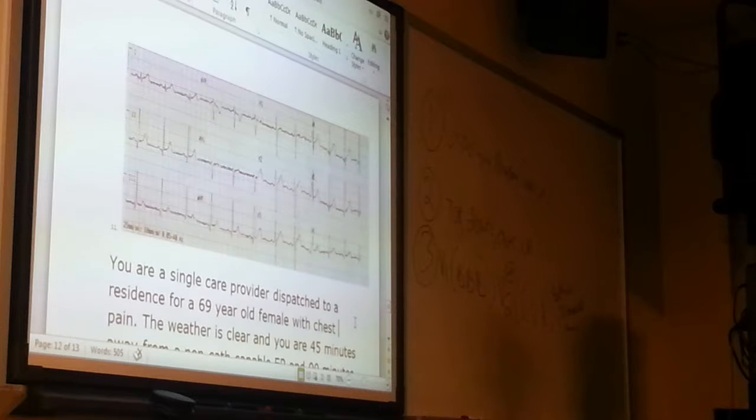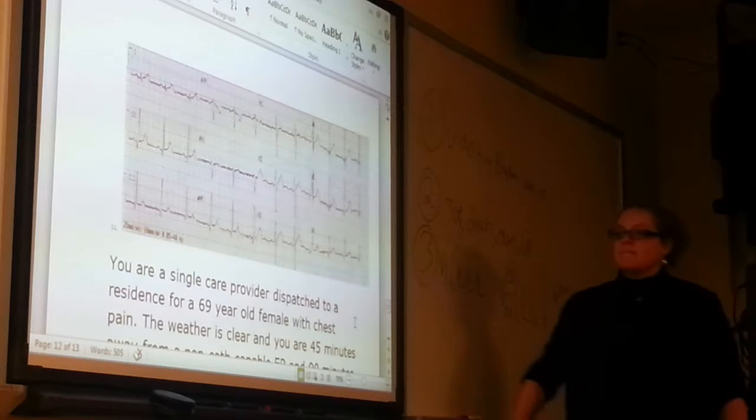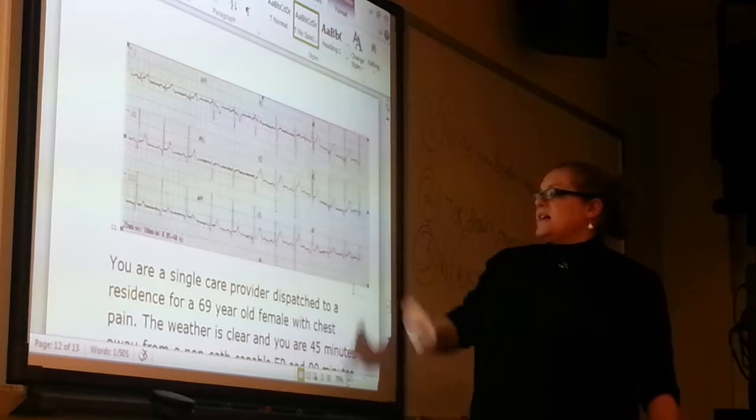In this case, kids, and I'm going to totally blow your mind here, they actually say that this is the beginnings of an anterior lateral MI. And now that I say it, look at it. Can you see it? I see it. But it's the beginnings. It's not actual ST segment elevation. It's not contiguous, but it's the start of it. Look at your anterior and lateral leads. What are your anterior and lateral leads, guys? V3, V4, V5, V6.